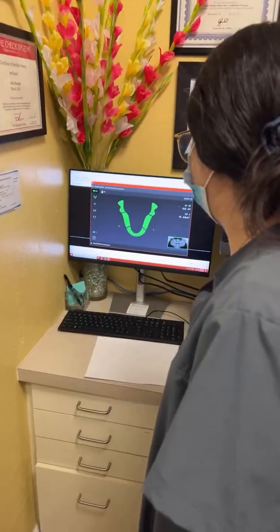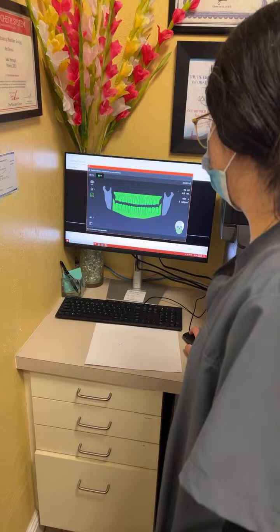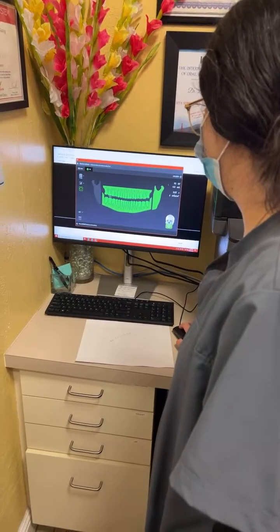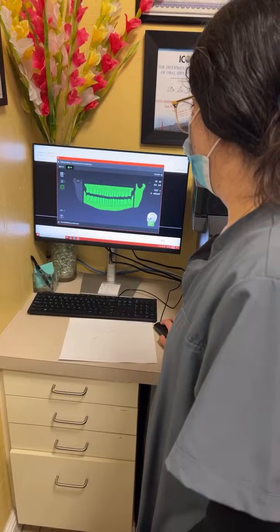Request patient scan in advance. Select patient, 3D. Right. I have no idea what upper and lower does that mean. Yeah, there we go. And you're on high res. Is that what you want? A panel too. No. Click on the jaw too. Both? Oh, different. Yes. You won't get both. Oh, it doesn't. You need the 9x14 FOV.